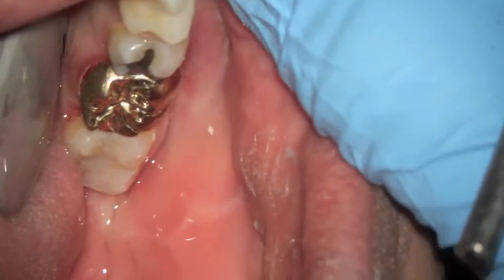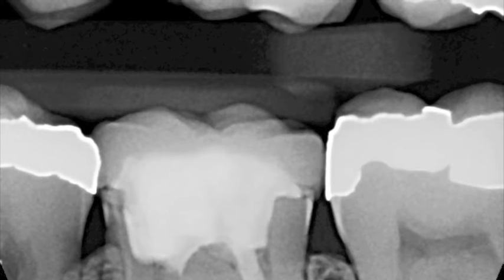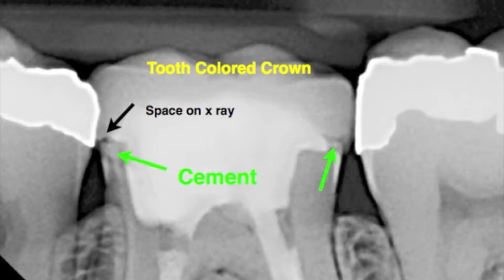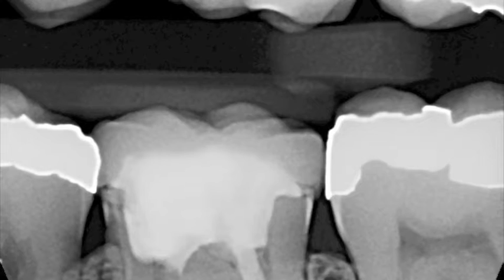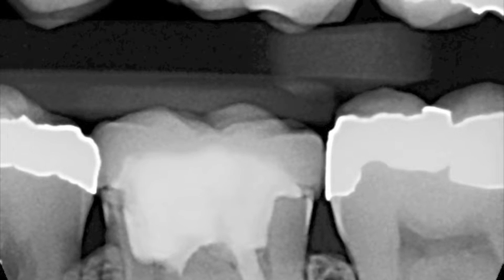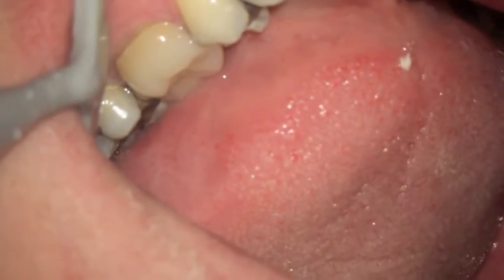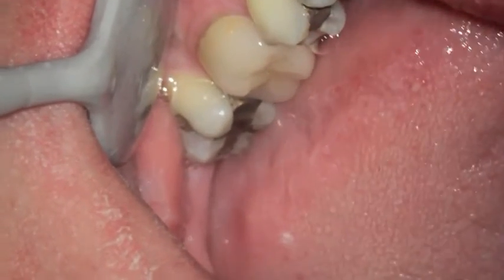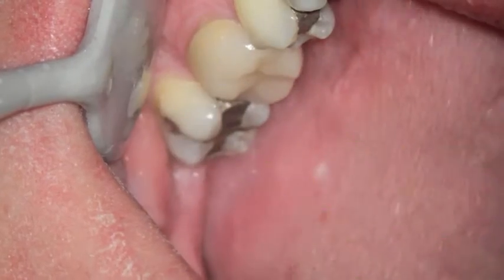Now we're going to take a look at another crown that was done on the other side within the last year by another dentist, and you can see the cement that's gone ahead and placed to keep the all ceramic or tooth colored crown in place, but there's a space between the cement and the crown, and when we take a look at the tooth we notice that there's a really good amount of space where the cement has already leaked away in that short period of time.